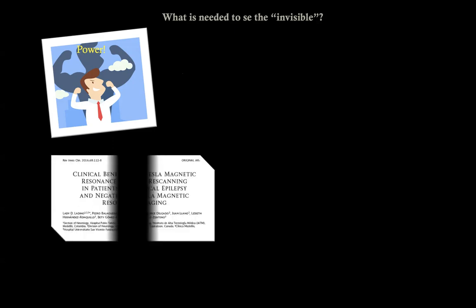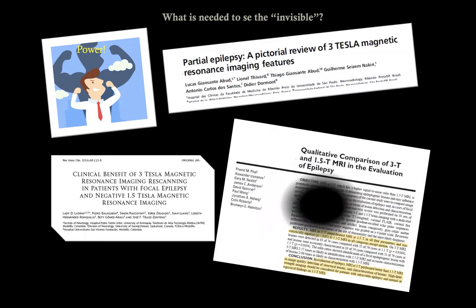So we use a 3 Tesla scanner. I know that in Nigeria, you guys have a 1.5 Tesla scanner or a scanner of 0.3 and so on. This is something that I would also like to present a bit in this talk: we are collaborating with UCL to try to improve the signal to noise ratio in 0.3 scanners in order to achieve 1.5 quality.